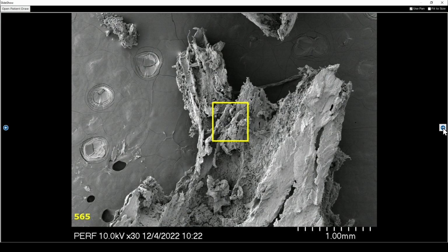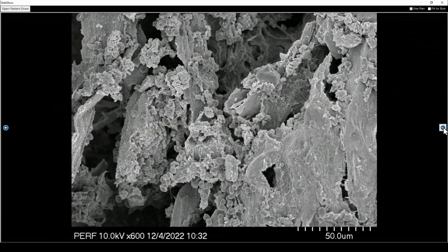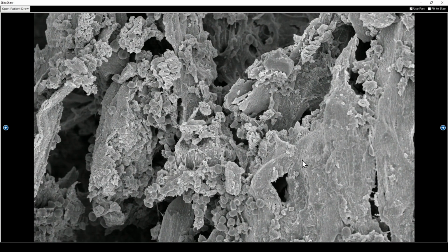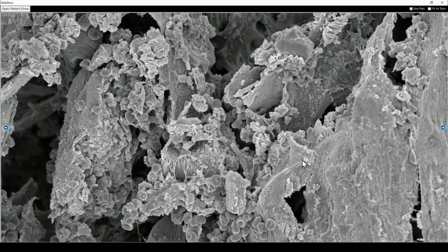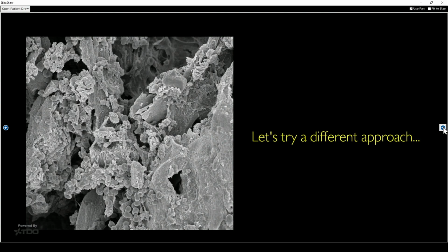There's obviously a lot of cellular debris and resorption going on, as well as infection. But actually looking for biofilms can be very, very challenging in this type of sample where there's so much going on. If you look closely, you can see, of course, white and red blood cells and a lot of connective tissue and some bone matrix in different stages of resorption.